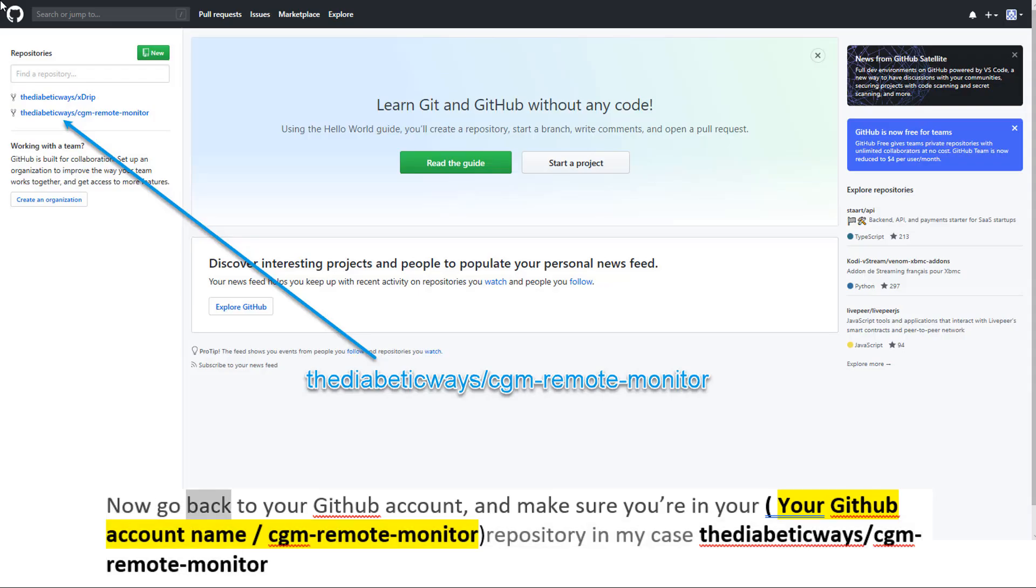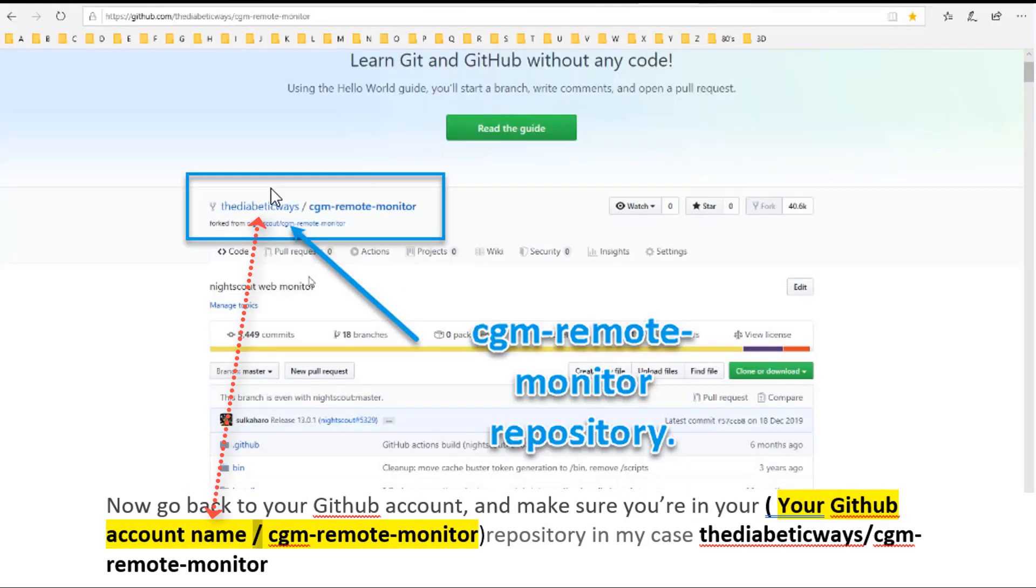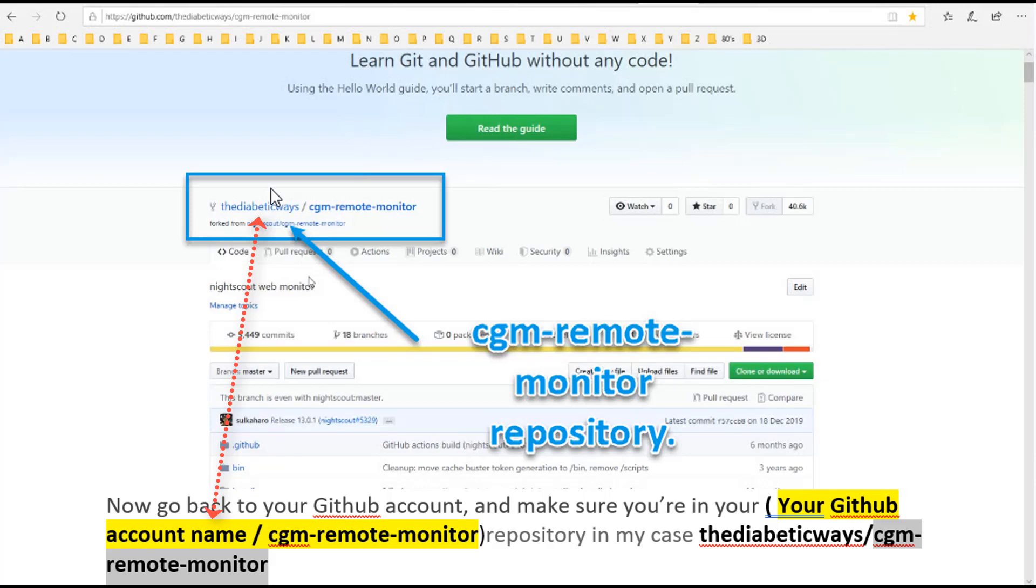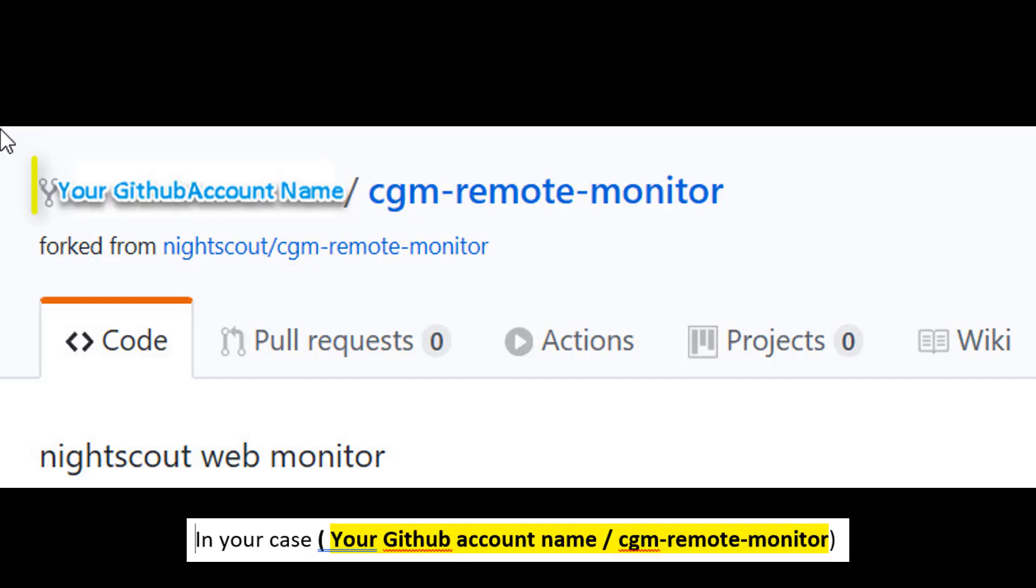Now go back to your GitHub account. In your case, your GitHub account name forward slash cgm-remote-monitor.